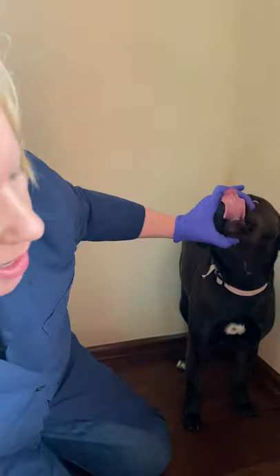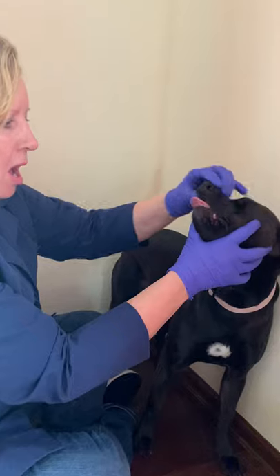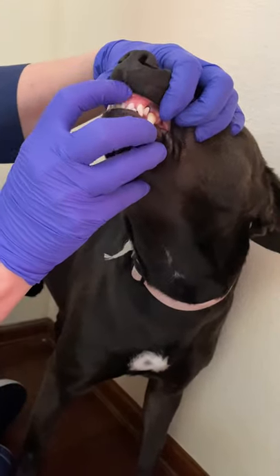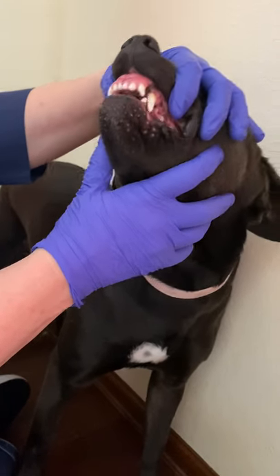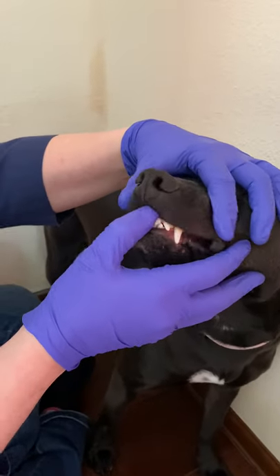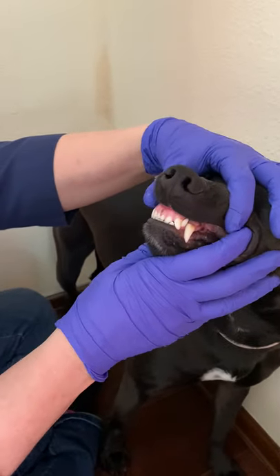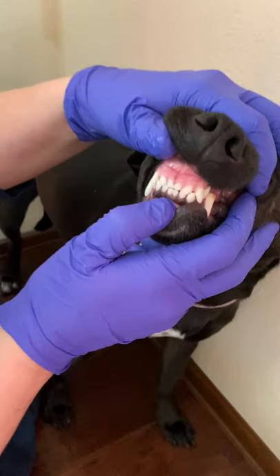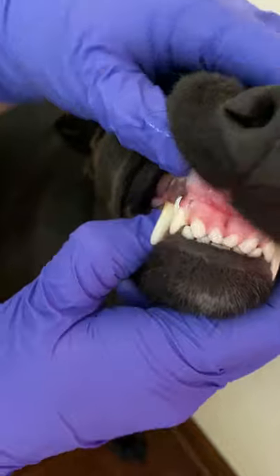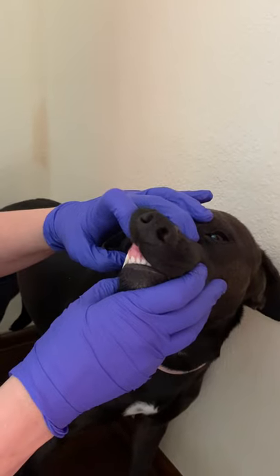We always want to look at this area. There's a little groove here, and in some breeds like a bulldog or a boxer it's a very deep groove. They can get fine hairs stuck in that groove when they're licking themselves, which can cause a really bad odor. When looking at the teeth themselves, we're looking at the gums for any redness or swelling, checking for any odor or halitosis.